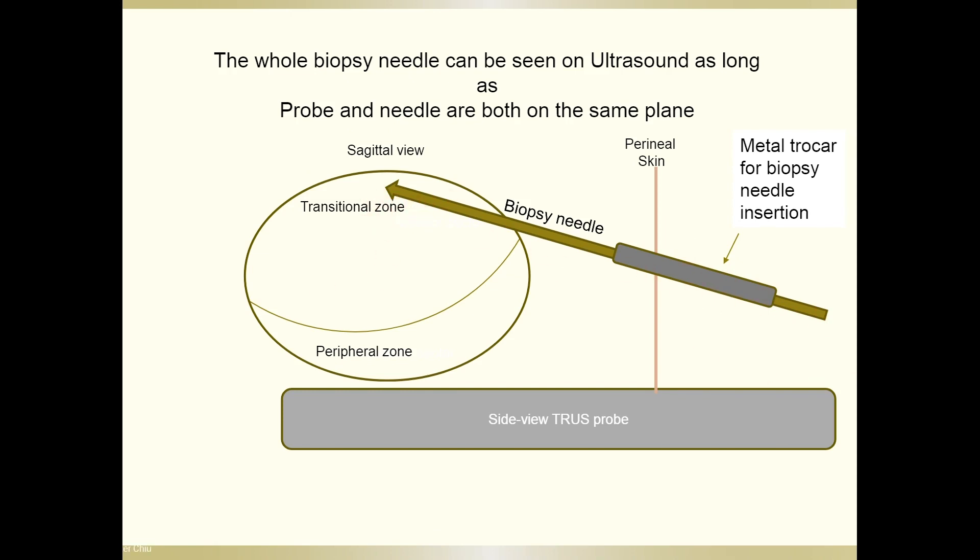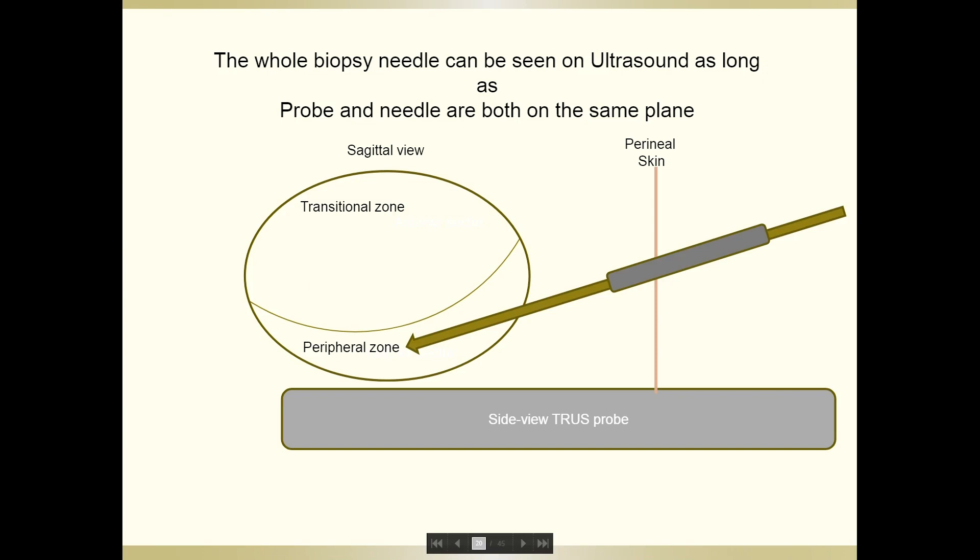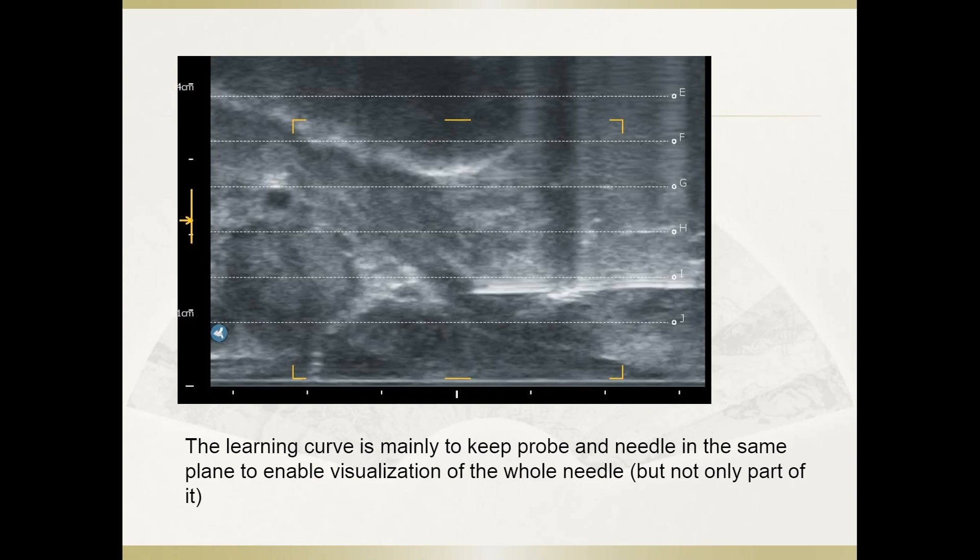The whole needle is seen on ultrasound as the probe and needle are on the same plane. This is the posterior sector, pointing towards the peripheral zone. The learning curve is mainly to keep the probe and needle in the same plane to enable visualization of the whole needle. It is actually dangerous if you can only see part of it, because you might be overshooting the needle into the bladder or outside the prostate.